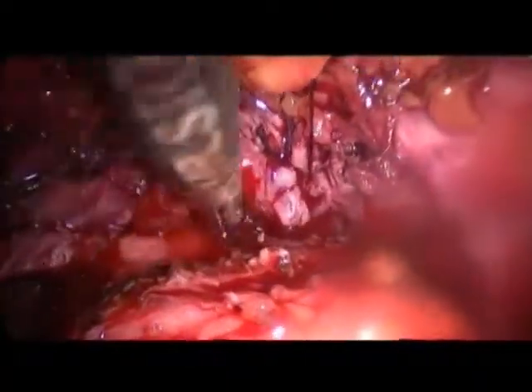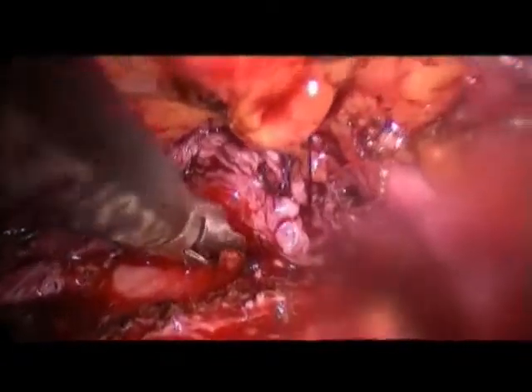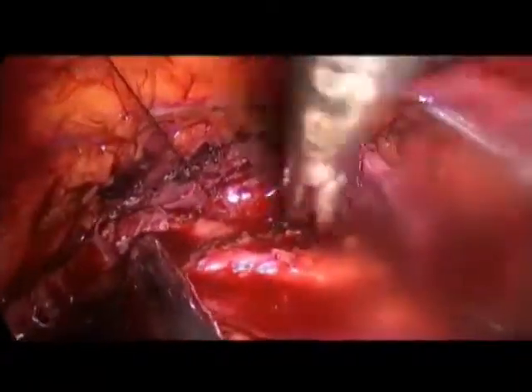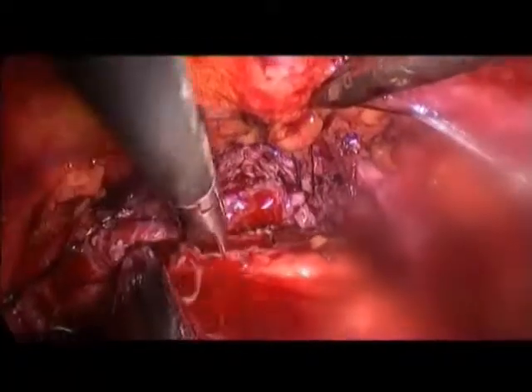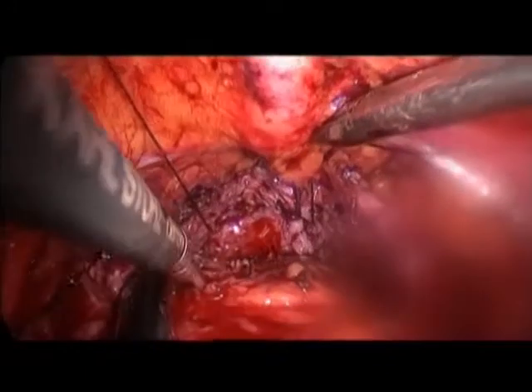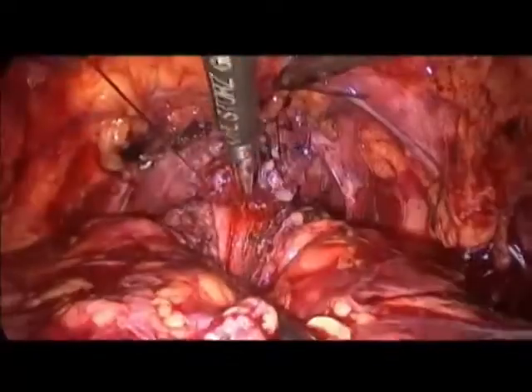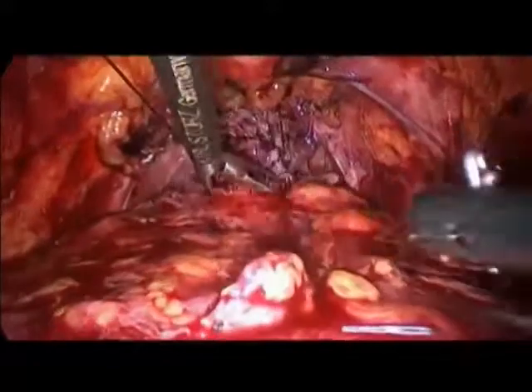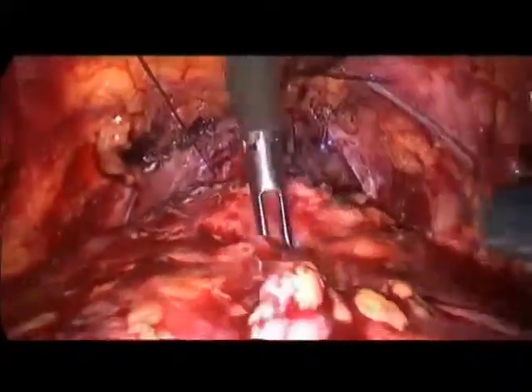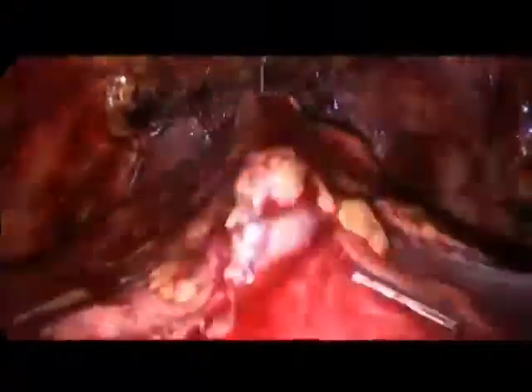The other option would be to use a Benique that you can buy in stores. I have it, which has a central perforation. Without redoing the anastomosis, you can put it in and insert a guide wire. Ones that are even used in open surgery have a central perforation. You see, now it's easy. Straight into the right position. Okay. And it's much less troubleshooting.